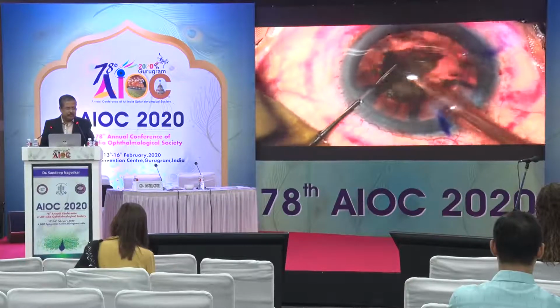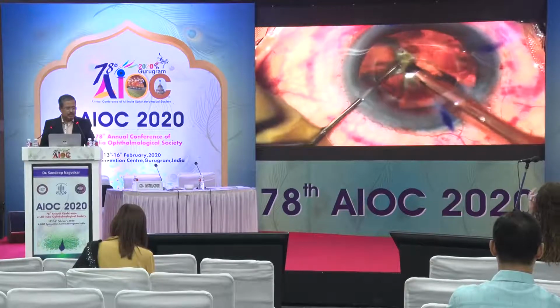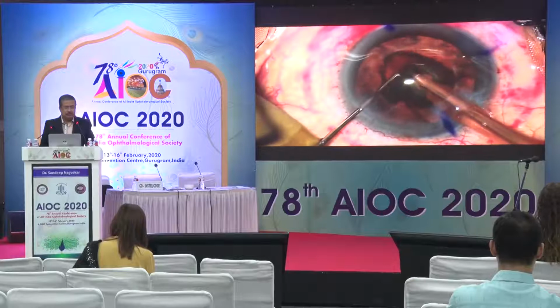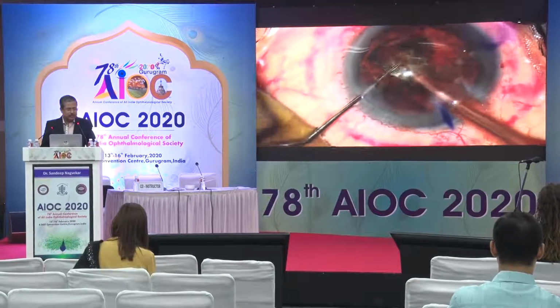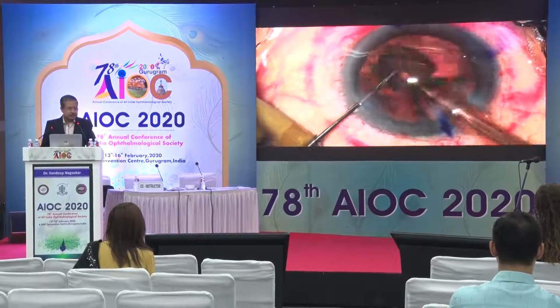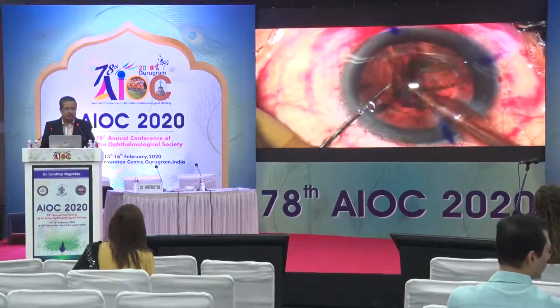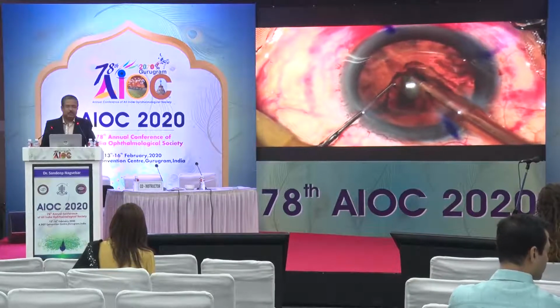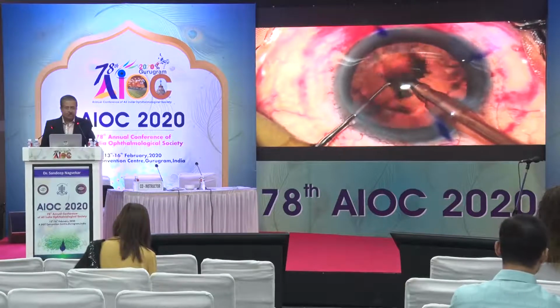It's maybe early grade 4, but it was hard, as you can see. Of course, the use of the femto made sure that it was very simple and very easy to make. And of course, one thing we have to ensure always is keep the chamber stable, because you're afraid about causing any potential damage to the corneal endothelium. So do not use very high vacuum when you're aspirating those pieces. At that time, the typical vacuum setting would be about 350 millimeters of mercury, and that should be enough.